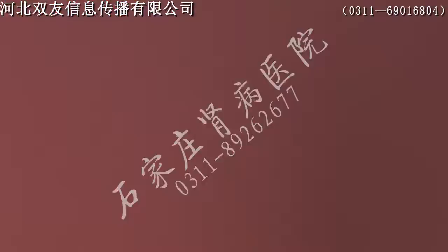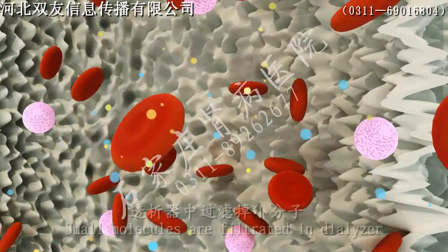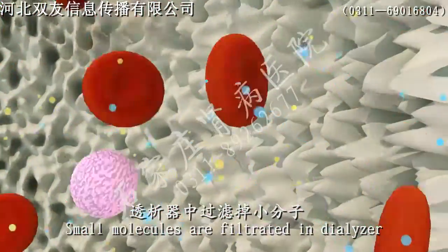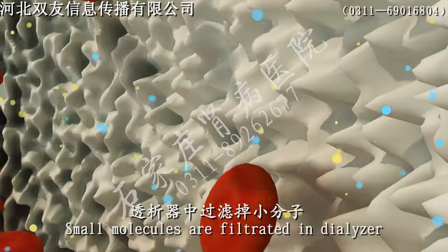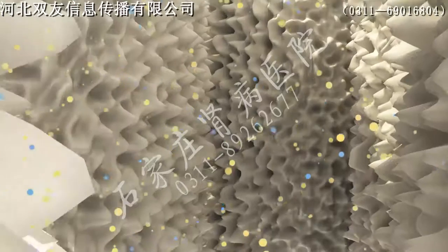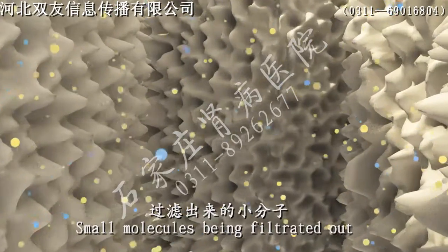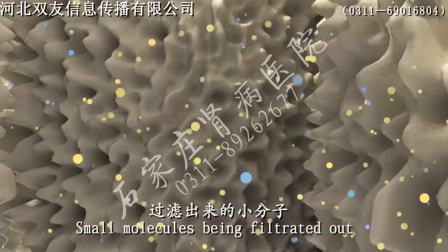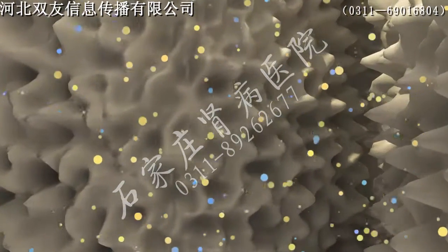Step 5. Blood flows into the hemodialysis machine after being adsorbed in the hemoperfusion device. Solutes move from highly concentrated solution to low concentration through a semipermeable membrane. Step 6. Blood and dialysate exchange in the machine via semipermeable membrane contact and concentration gradient to clean solutes.